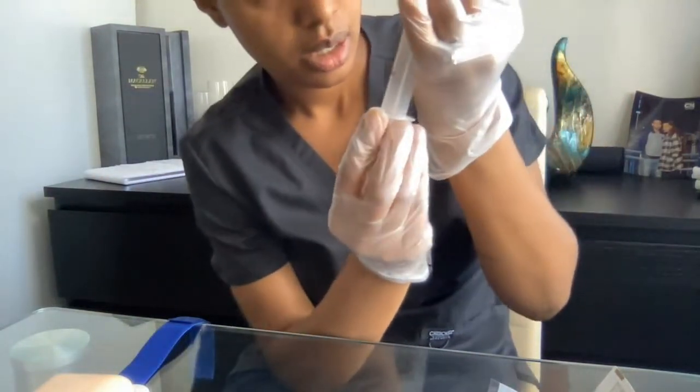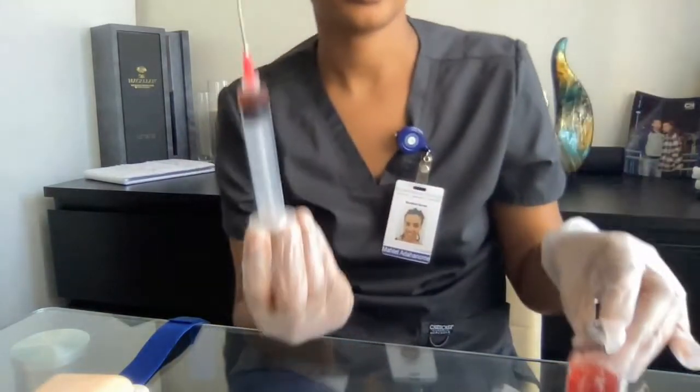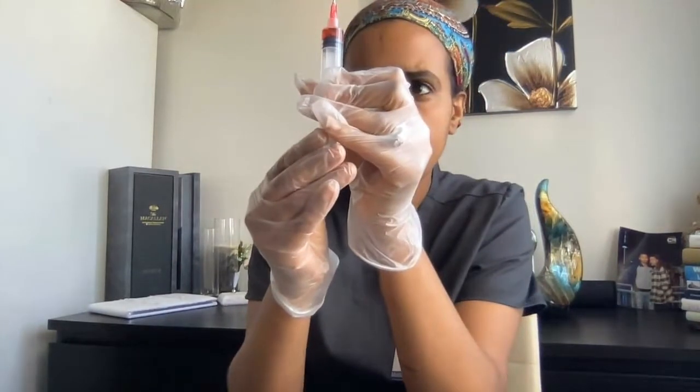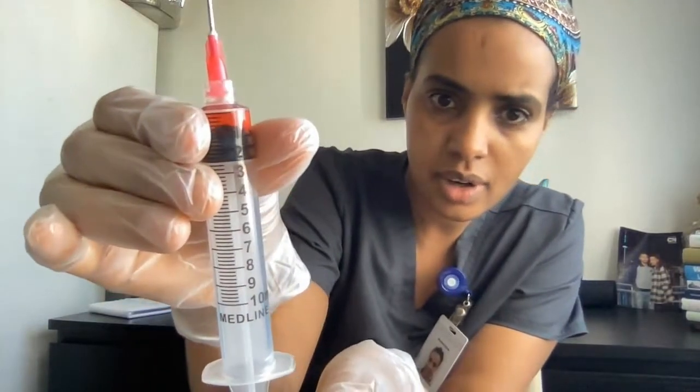And then I draw up 1 milliliter. I make sure there are no bubbles inside. Then I put the lid back on just to prevent any needle stick injury as I'm going to my patient's bedside. Okay, I'm going to go.